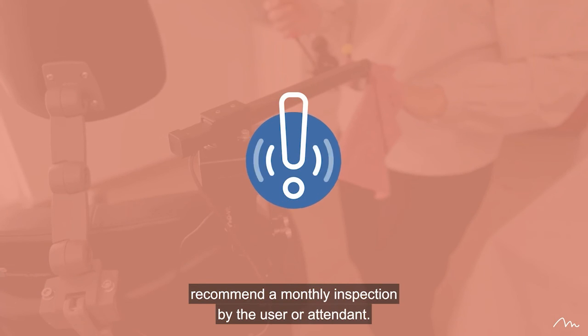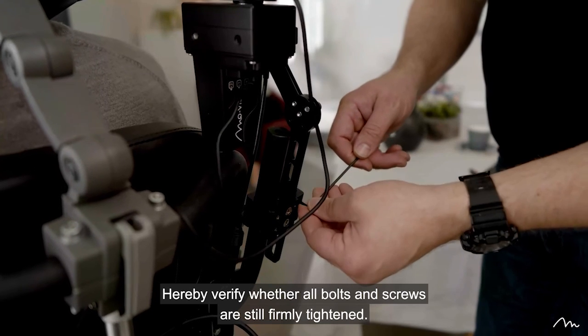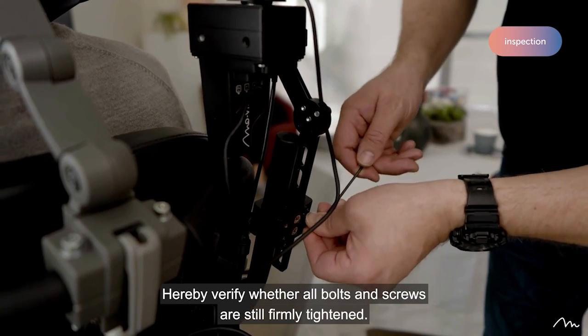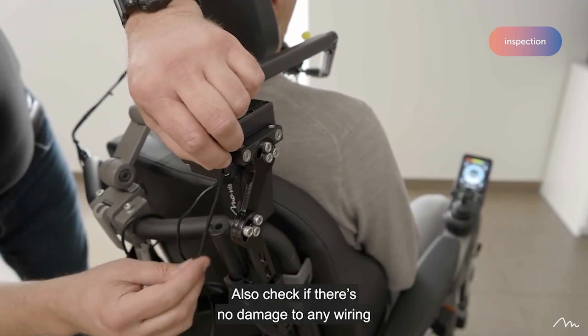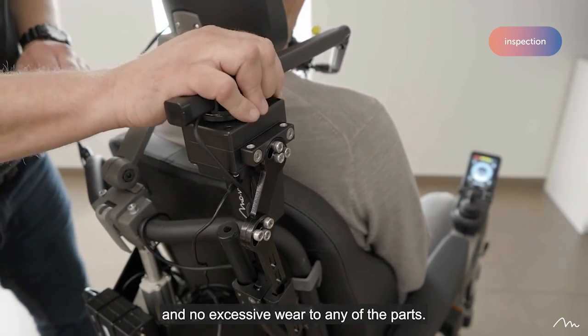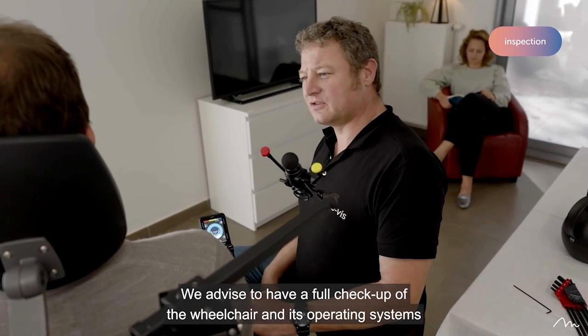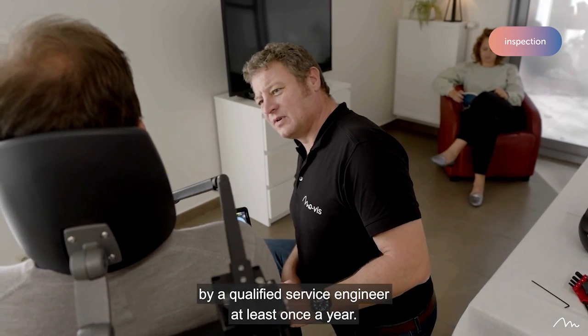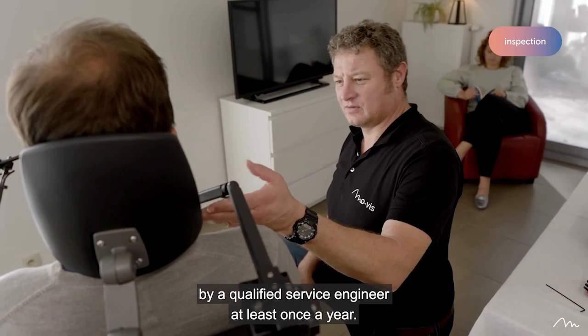We do recommend a monthly inspection by the user or attendant. Hereby verify whether all bolts and screws are still firmly tightened. Also check if there's no damage to any wiring and no excessive wear to any of the parts. We advise to have a full checkup of the wheelchair and its operating systems by a qualified service engineer at least once a year.